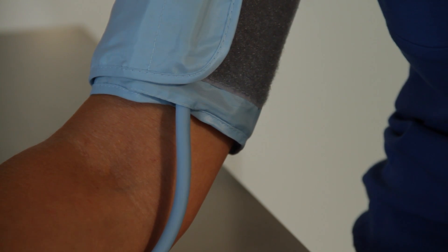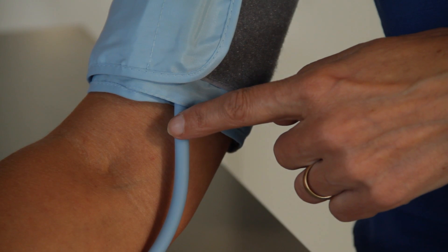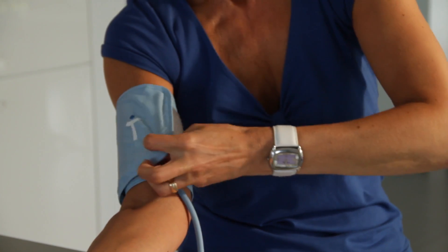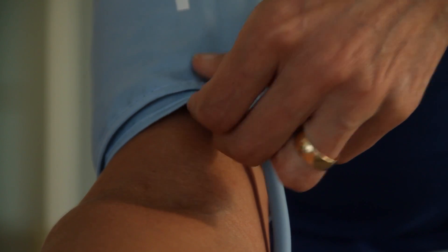Remember, the cuff must be wrapped around your arm one or two centimetres above the elbow joint, with the rubber tube running down the centre of the arm. Use your free hand to adjust the tightness of the cuff until it is firm. To ensure the correct tightness, you should be able to fit two fingers under the cuff.